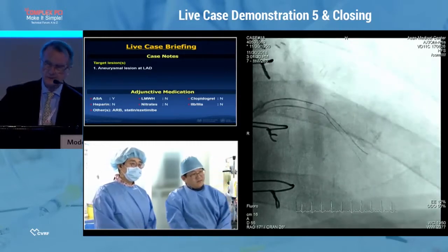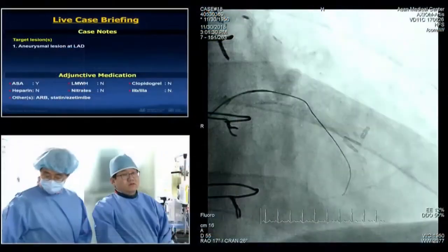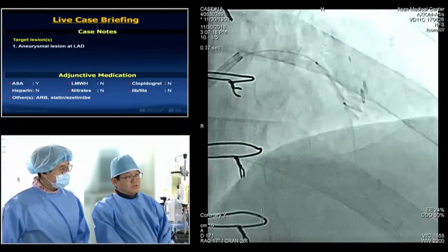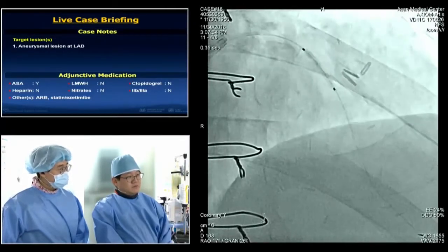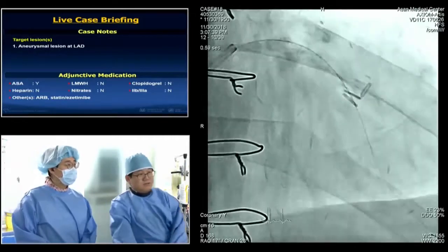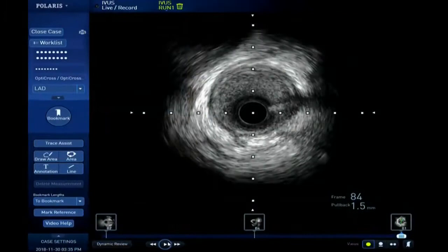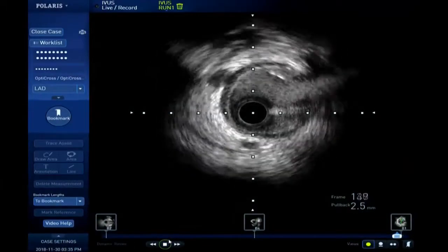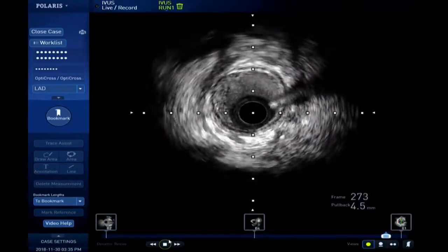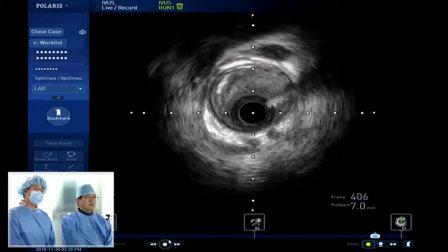XTR wire. So next, I applied a 2.0 high pressure balloon. After exchange to the strong backup support wire, I inserted the IVUS catheter and evaluated with IVUS. Please look at the IVUS. Middle LAD is 3.0, no disease at all, and some negative remodeling, mild plaque.